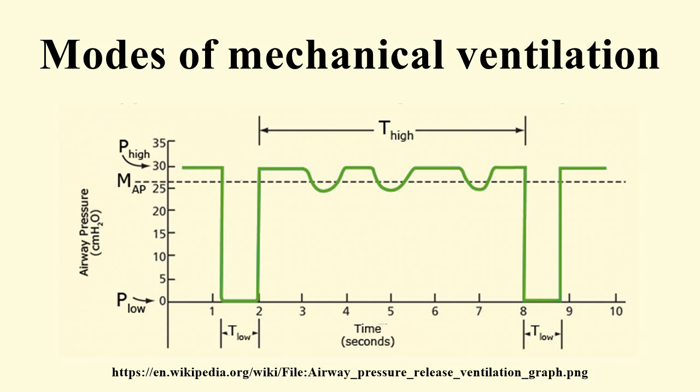A breath is assisted if the ventilator does work on the patient. An assisted breath is one for which the ventilator does some portion of the work of breathing. For constant flow inflation, work is defined as inspiratory pressure multiplied by tidal volume. Therefore, an assisted breath is identified as a breath for which airway pressure rises above baseline during inspiration. An unassisted breath is one for which the ventilator simply provides the inspiratory flow demanded by the patient and pressure stays constant throughout the breath.